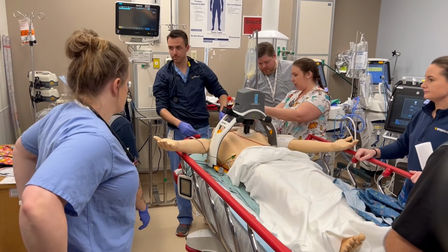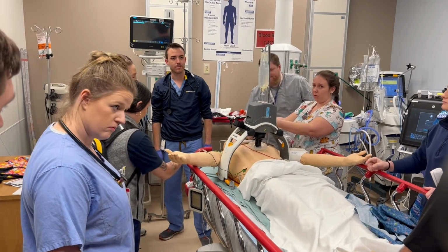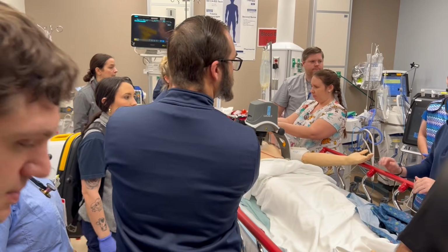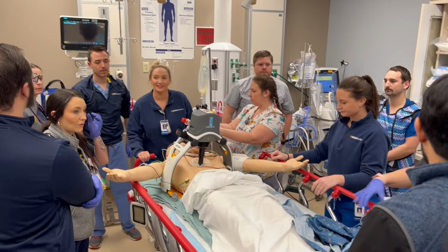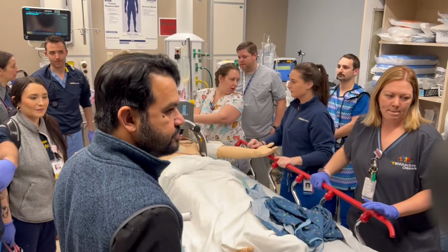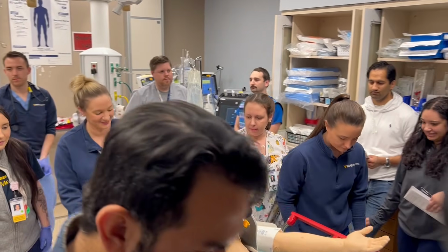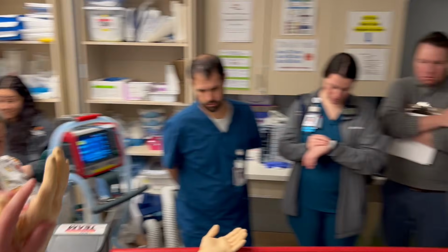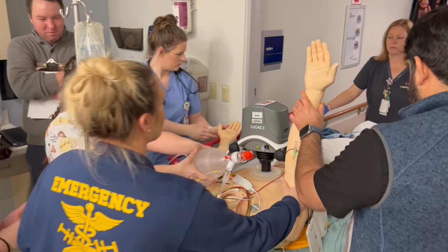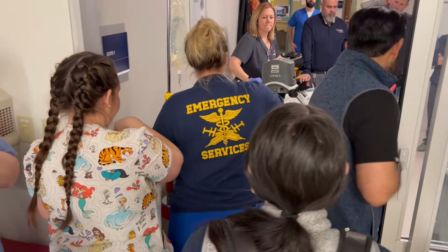We need a nurse for documentation and a nurse for medication. Okay, I'm going to. You're going to? Okay. Also due for another epi. All right, let's get the dose of epi before we walk. Are you documenting? All right. Alex is coming. So we turn to the right.